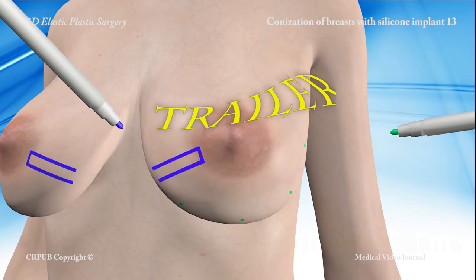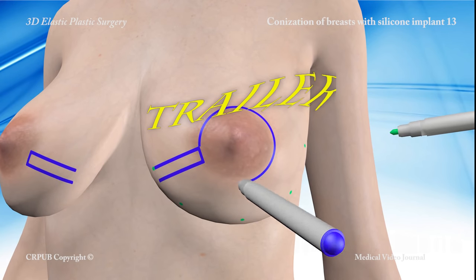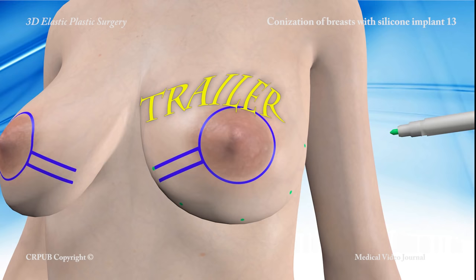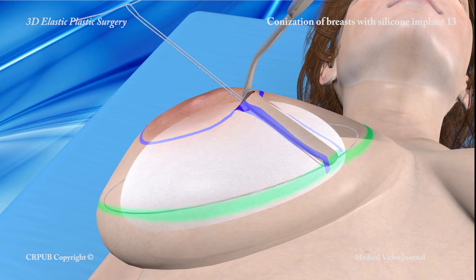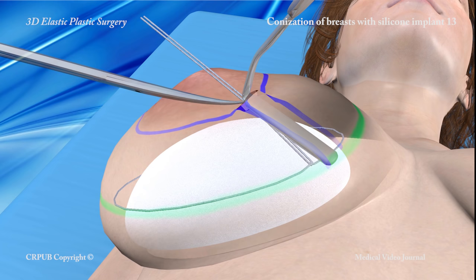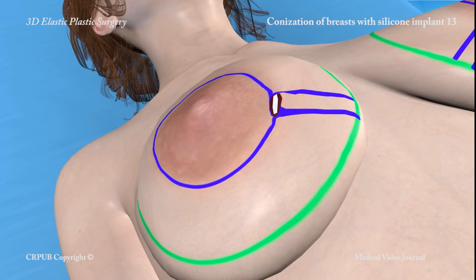This ambulatory elastic plastic surgery procedure can be used both to give small breasts a more natural look and to correct the so-called ball in a sock appearance of larger breasts. When the elastic threads are placed under tension and knotted, they press the implant against the chest wall and conize the breast, giving it a more natural appearance.